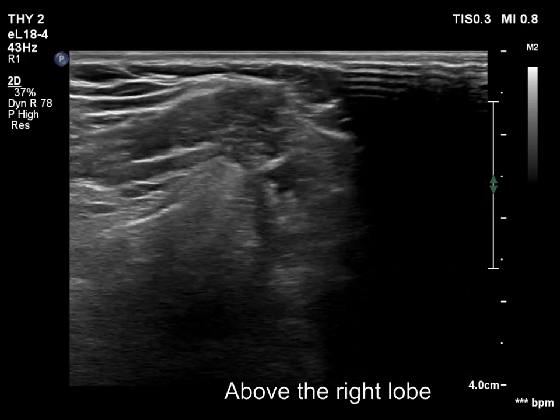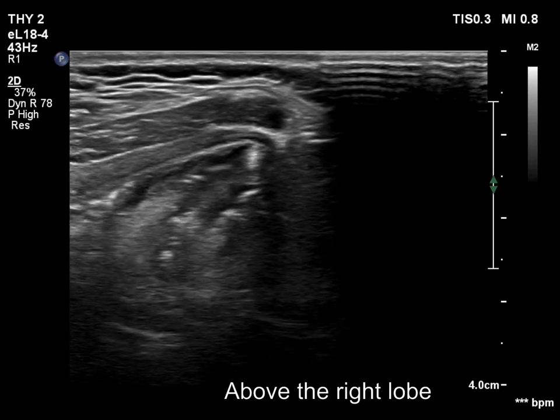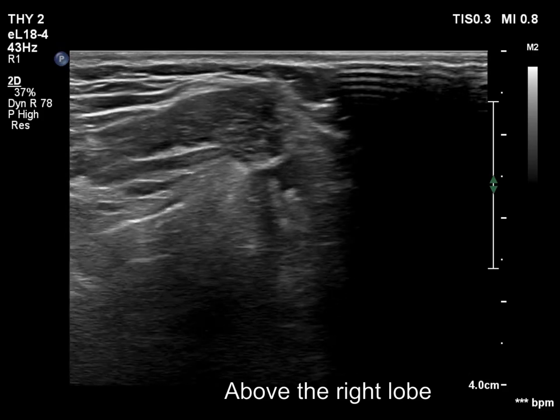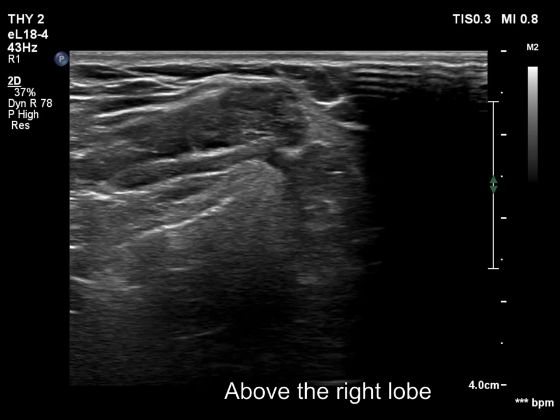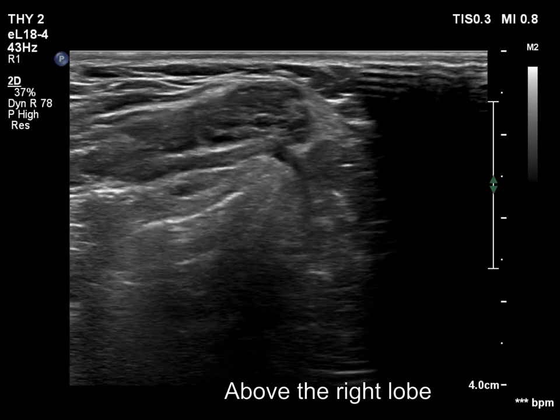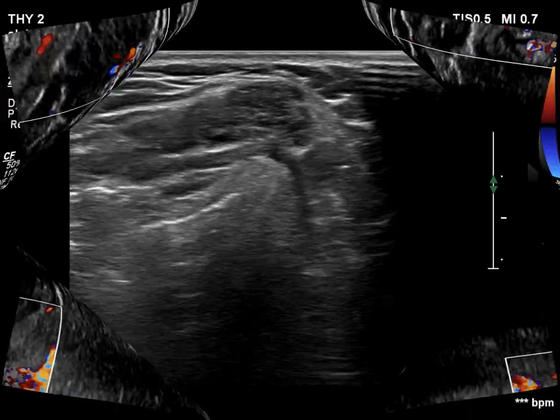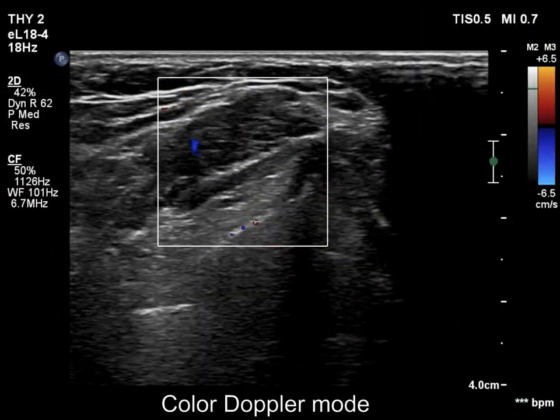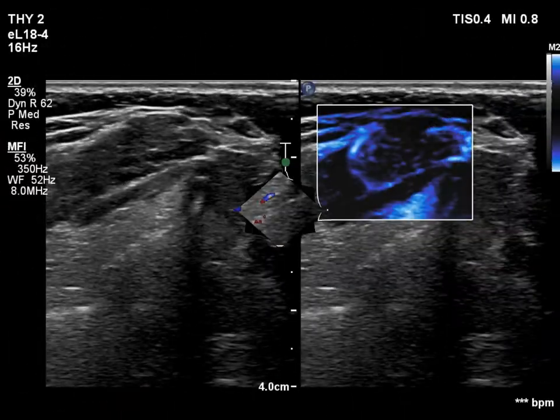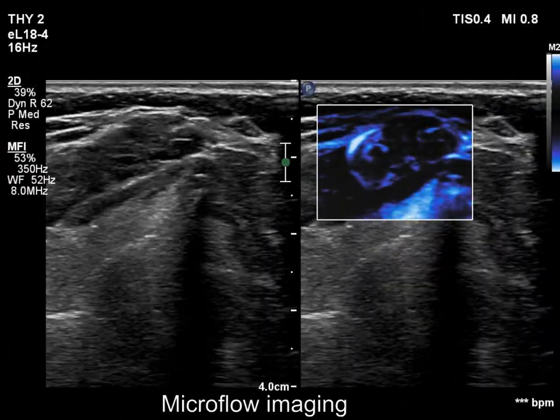Now, again the ectopic tissue is demonstrated. The pattern resembles the thyroid before surgery. The mass has vascularity in several vessels.